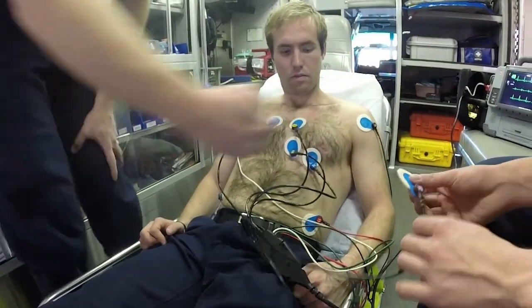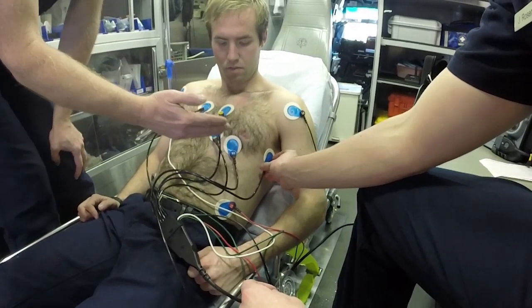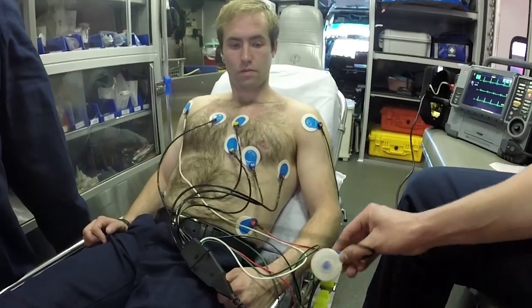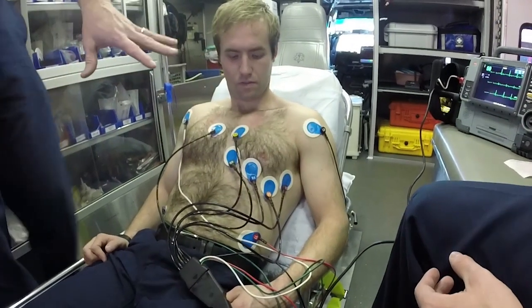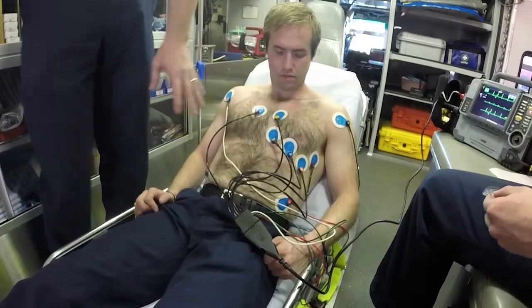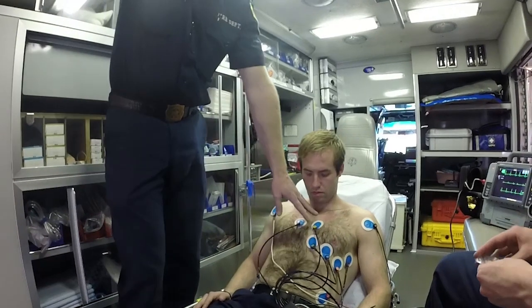Go with V6 next — V6 is mid-axillary. So mid-axillary line, and believe it or not, when your ribs go around, they curve up like this, so you are kind of following that curve of the chest line. And then V5 will just go in between V4 and V6. That is very good 12-lead placement right there — I would feel incredible about this. These are lateral, about as lateral as you can get without being on the hip bone, and it's as low as you can get with the belt line. You could go a little bit lower if his pants were a little lower, but these I feel very good about.